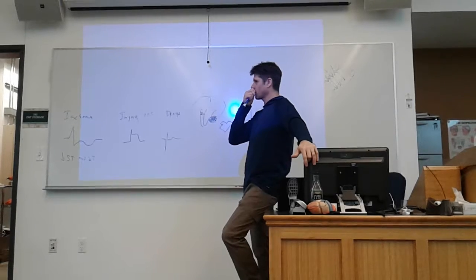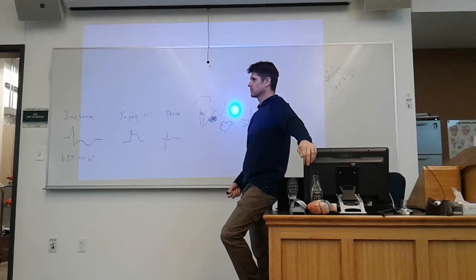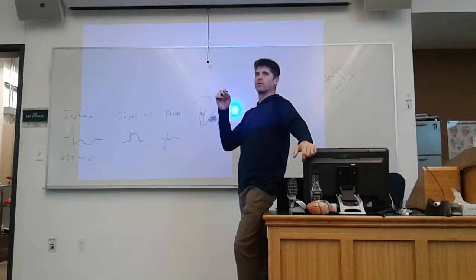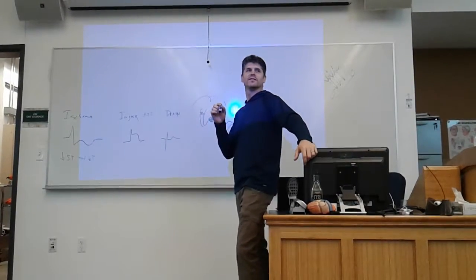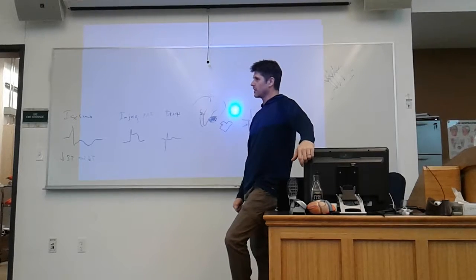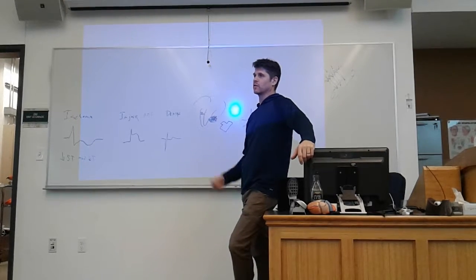So it's possible that you could see ischemia on your EKG, but the chief complaint is respiratory distress. Could be. And once you fix the respiratory, it comes back. Yes. Anything that's causing the potential for, don't step on it wherever it fell. Okay. Anytime you have anything that's leading to the heart not receiving plenty of oxygenation will cause that heart to become ischemic. And that can lead it to have an MI. Absolutely.